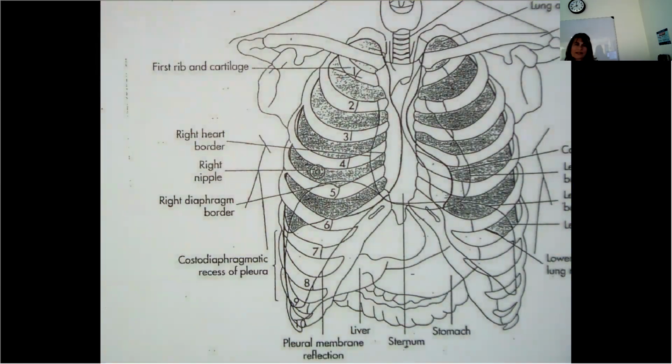So I don't know how I did this on the exam, because with a multiple choice, there's no way for you to indicate where these leads would go. I'll look it up during lunch break and I'll let you know. But in the meantime, tell me where V1 would be placed. Right of sternum, on the right side.